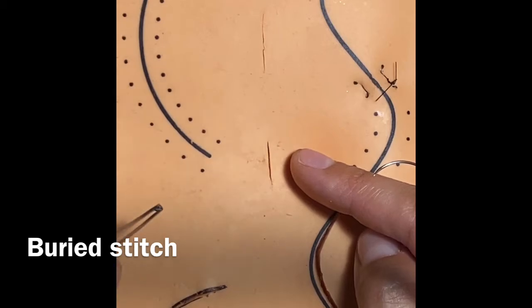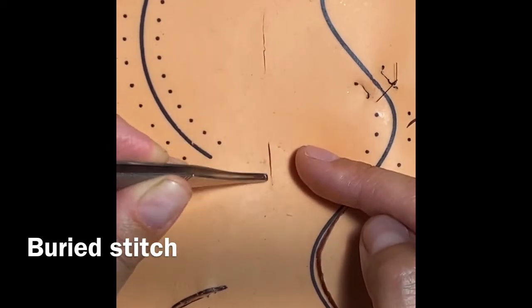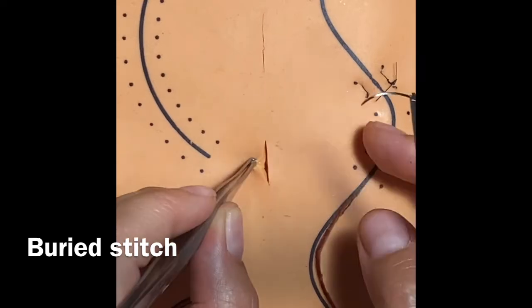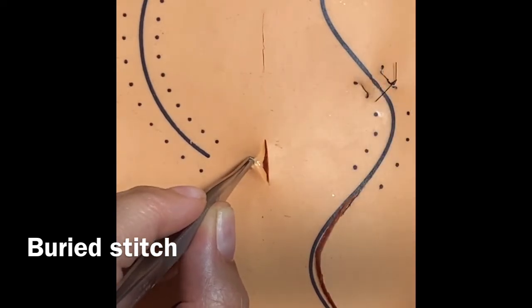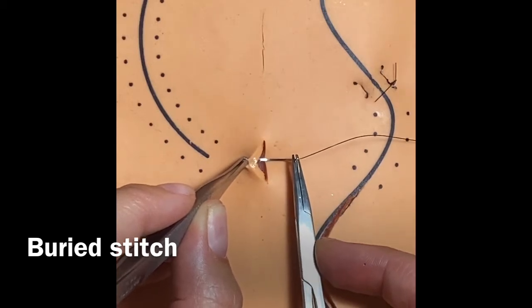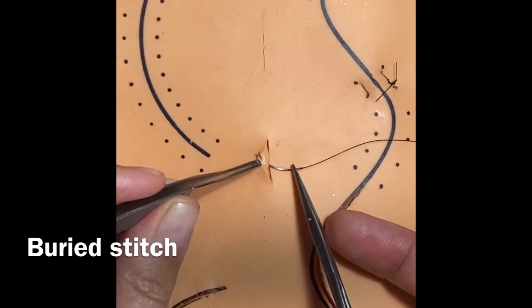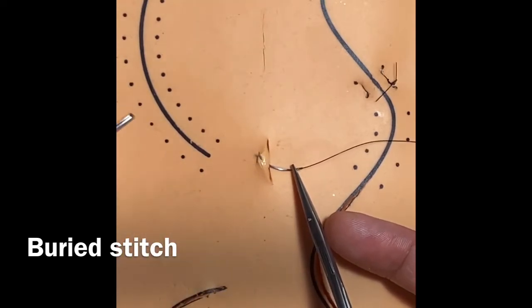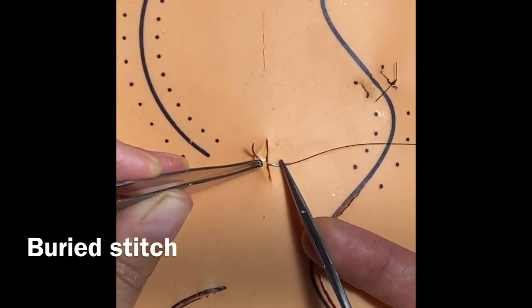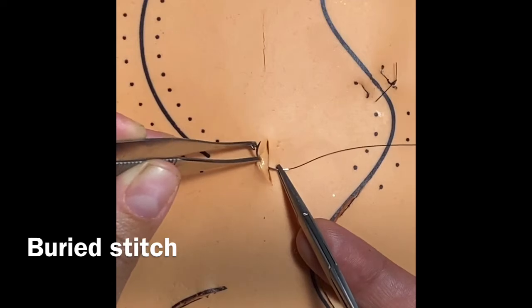So the way to do this is you ideally want to close this with 1 stitch that you don't see. Okay, so if you're right-handed, you're going to start on the left side of the wound. You're going to go in the deep layer and come out in the junction between the epidermis and the dermis. It's hard to see on this kit, but on real skin you can see the area just below the epidermis where you're going to come out.